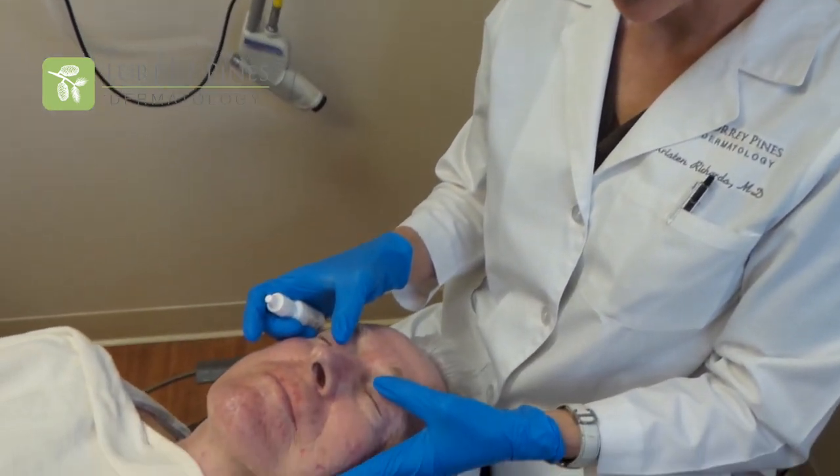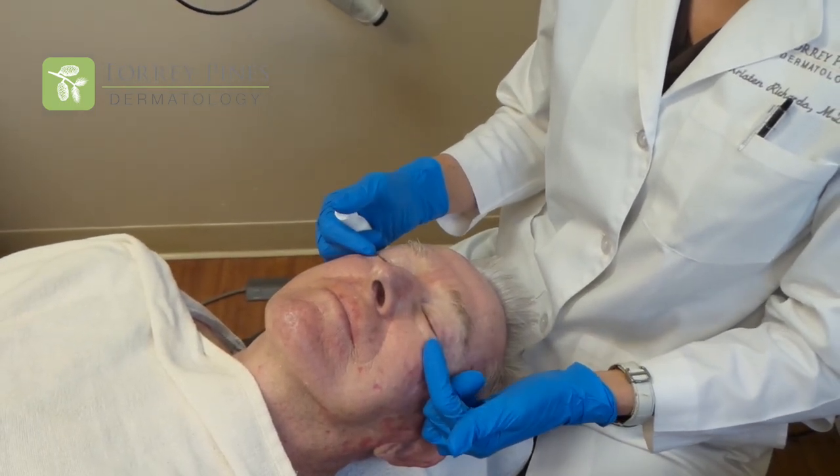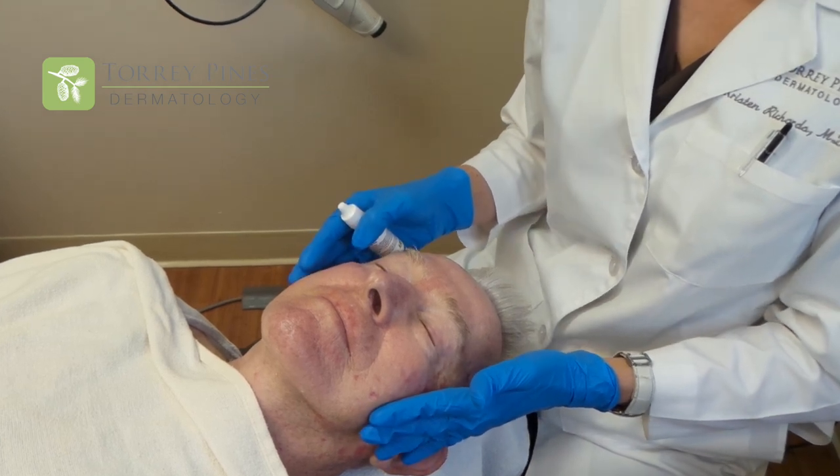The first part of the procedure involves putting in opaque eye shields. We want to protect the eyes because we're actually going to be treating way up to the lash line, both on the upper lids and on the lower lids. We want to make sure that the patient's eyes are fully protected prior to starting the laser.